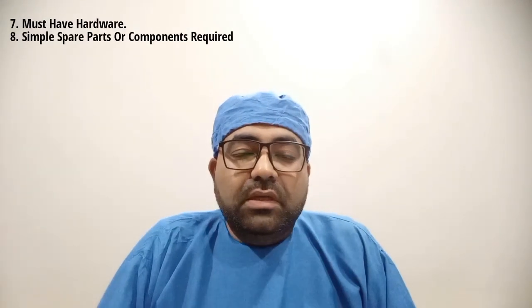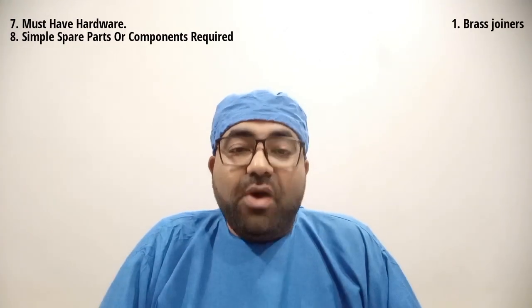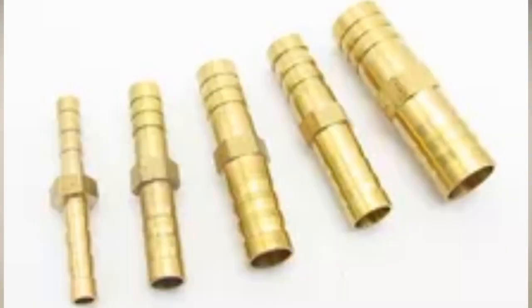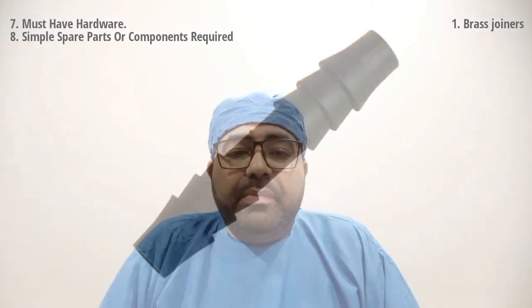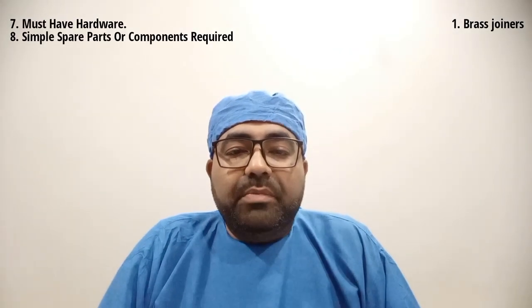The next point is number 8: simple spare parts or components required to repair any water leakage yourself. The first component is brass joiners. I prefer brass joiners more for water leakage repair. Similar kinds of joiners are also available in plastic material, but plastic joiners are very less durable compared to brass joiners, so I would suggest you to get only pure brass joiners.